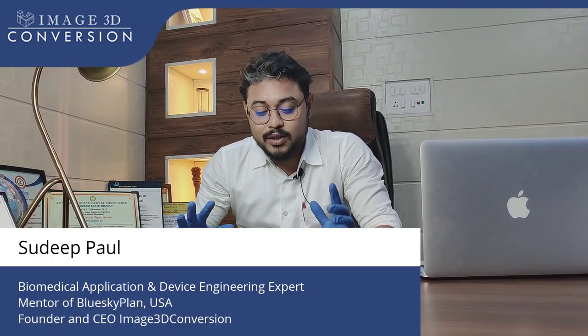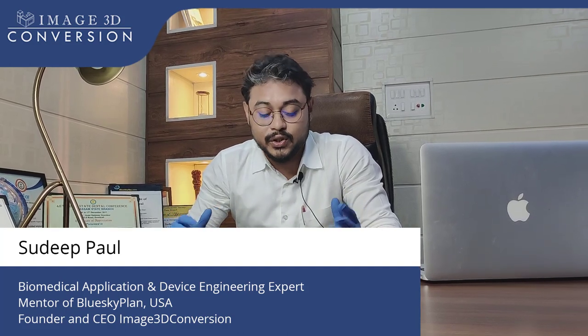Hi, I am Sudik Paul, I am a guided surgery expert. Today I am going to display one of the cases of full arch surgery.